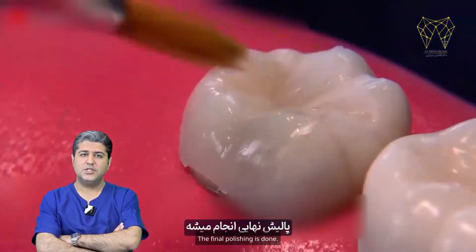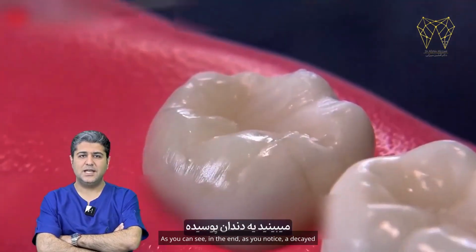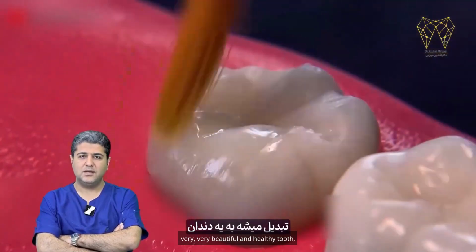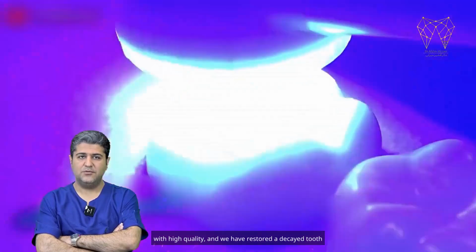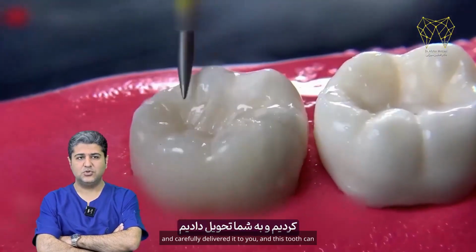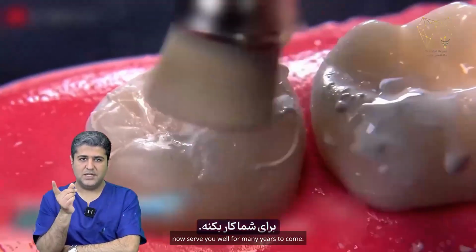The final polishing is done. As you can see in the end, a decayed tooth is gradually and completely transformed into a very, very beautiful and healthy tooth with high quality, and we have restored a decayed tooth and carefully delivered it to you. And this tooth can now serve you well for many years to come.